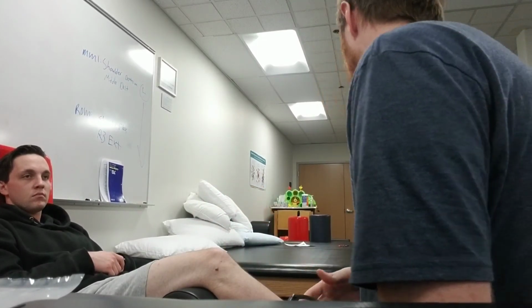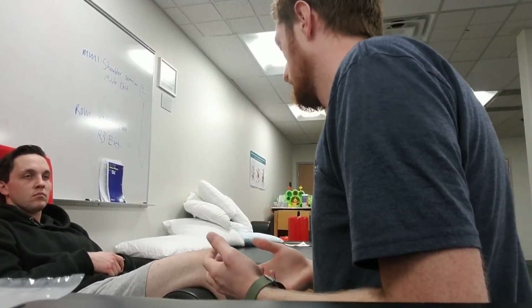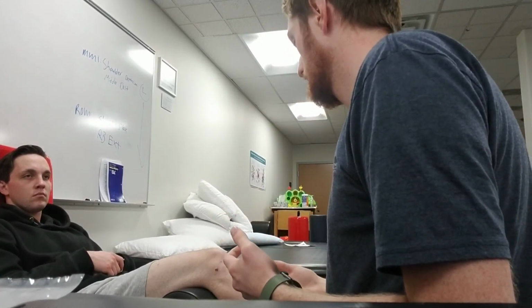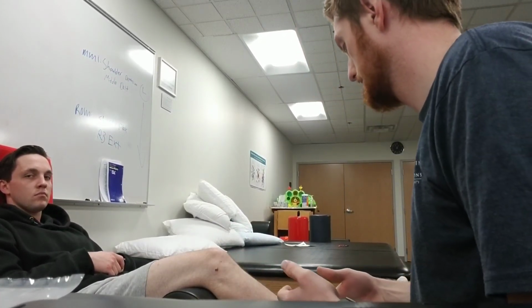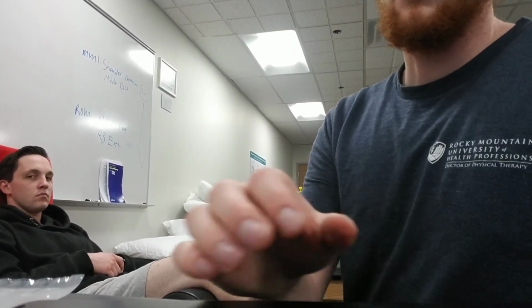We can change some of the settings on here. It's a bit more of an intense sensation while you're getting the therapy, but the pain control tends to last a little bit longer. Okay, but we'll cover that later if we need to. All right, we are all set.